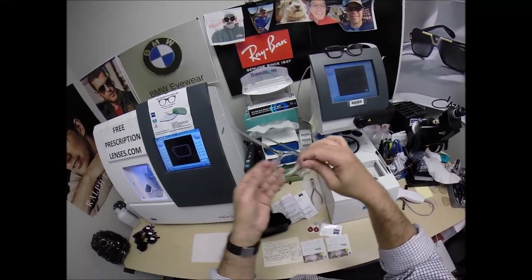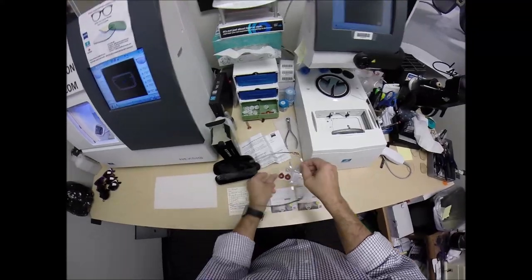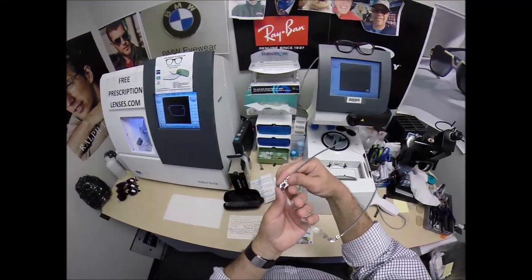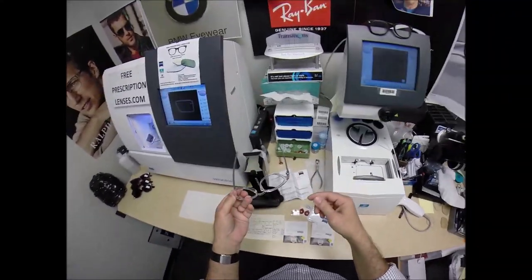Now you can have an optician use heat here. You can pop the lenses out just like I'm gonna do to cut your lenses. Take the lenses out, the prescription lenses I'm about to install. You can have them use heat or the glass bead pans. If these were too tight, you can bend them outward there, or if it's too loose, you can bend them inward to make them a little bit more snug.